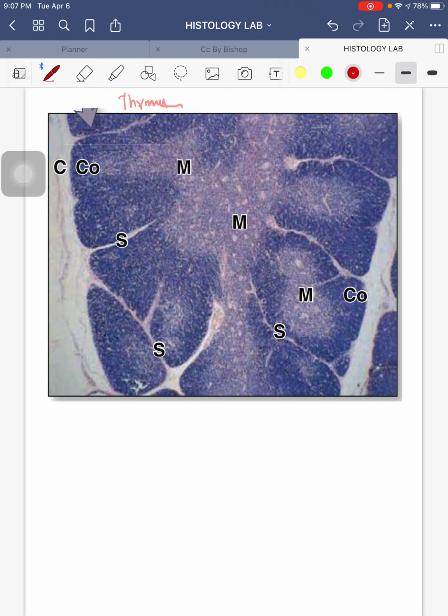So the first organ here you have is your thymus. Your thymus is a primary lymphoid organ and it functions for induction of central tolerance. So it will prevent autoimmunity, meaning your cells will attack its own cells. They originate from the third pair of pharyngeal pouches, specifically in the endoderm region. That's just nice to know, because in your manual there was a question about where it originated.